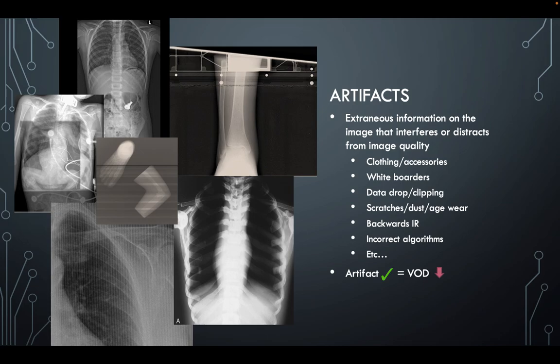If, let's say, I'll use a pelvis as an example, because this is probably the most frequent place that I've seen this happen. If I overexpose a pelvis, I am going to send too much technique. I have too much signal, and so the values of interest get a little skewed.